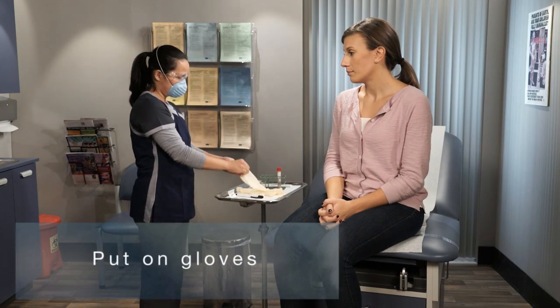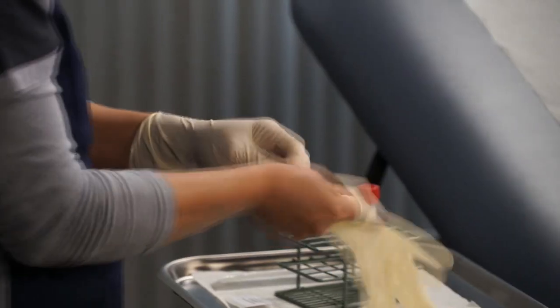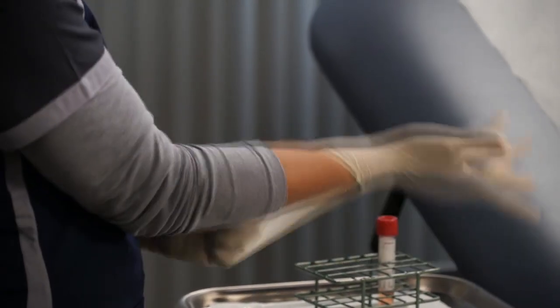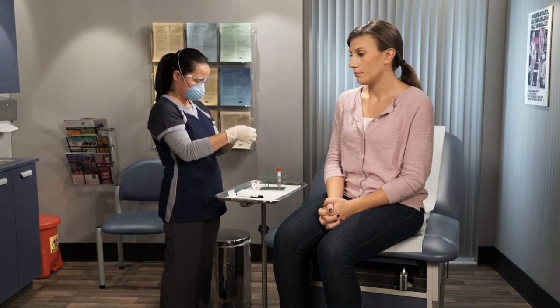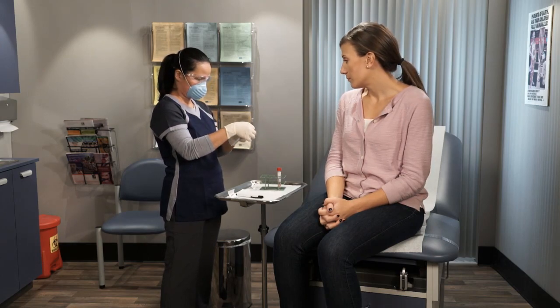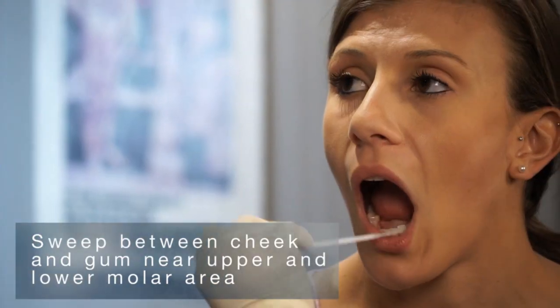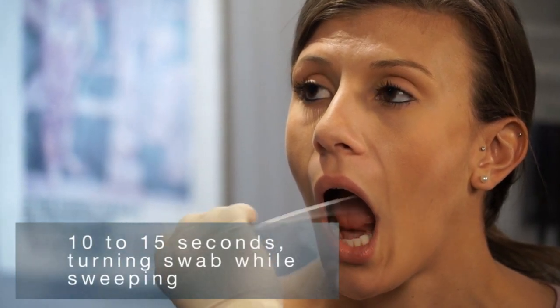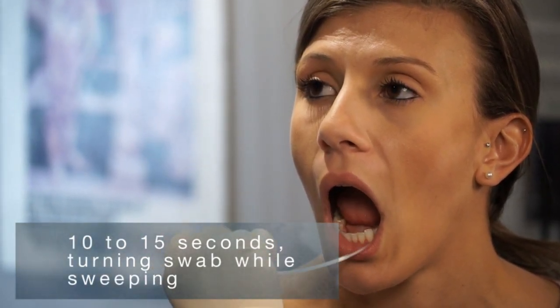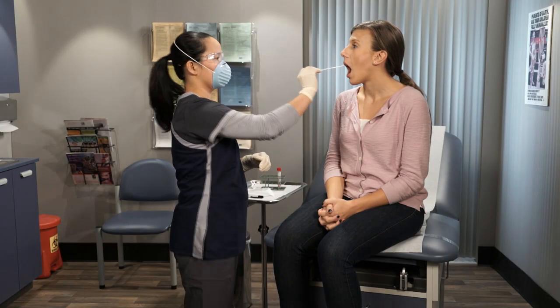Put on gloves. Sweep the swab between the cheek and gum near the upper molar to the lower molar area across the duct for 10 to 15 seconds, turning the swab while sweeping. Sweep both sides.